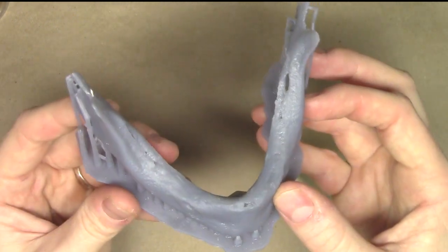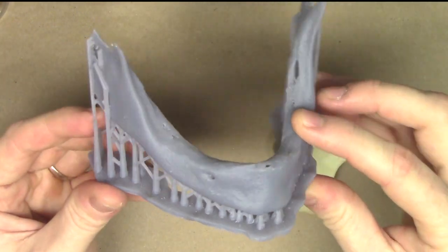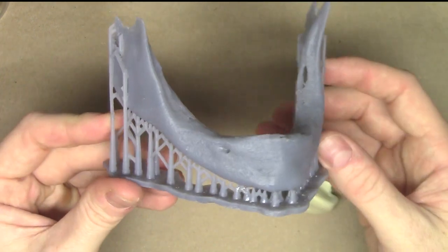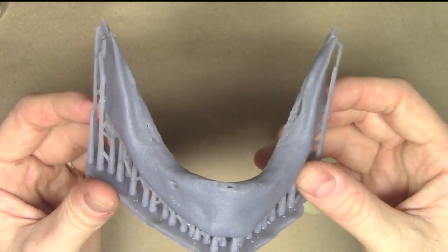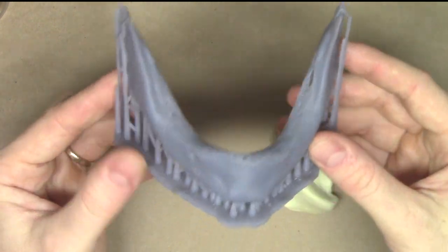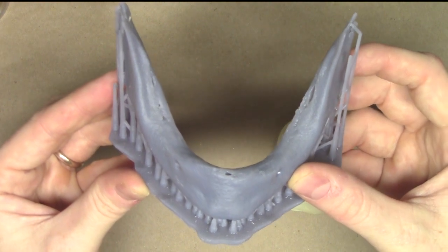However, many clinicians do choose to lean in the direction of a standard diameter implant here because of the prosthetic flexibility associated with it and also the increased surface area. However, I've treated many patients just like this very successfully with a narrow diameter implant, especially the LOCATOR overdenture implant.